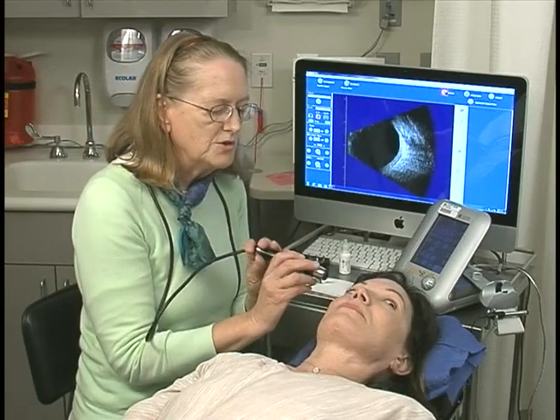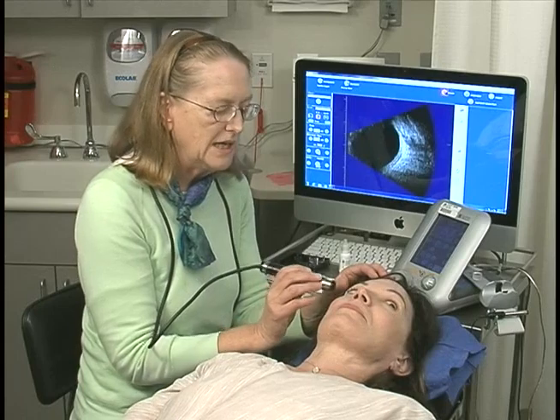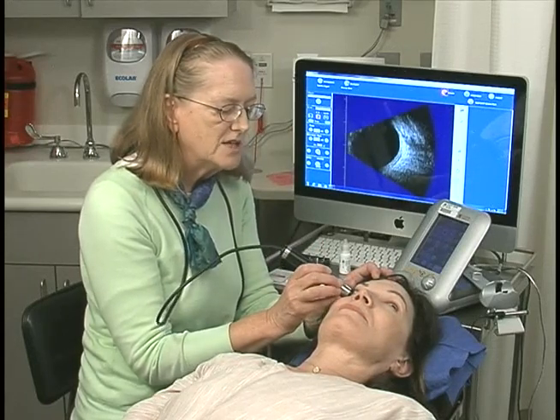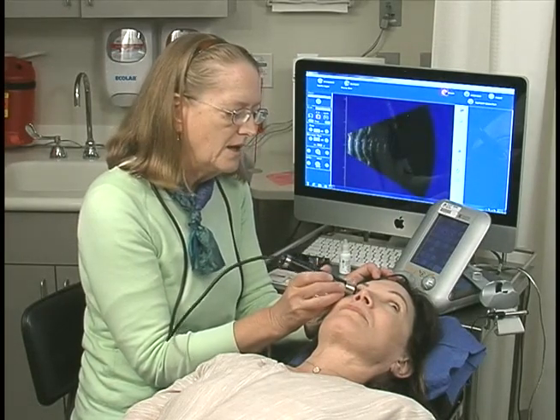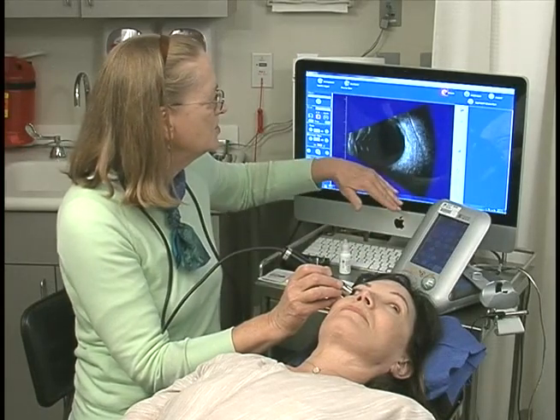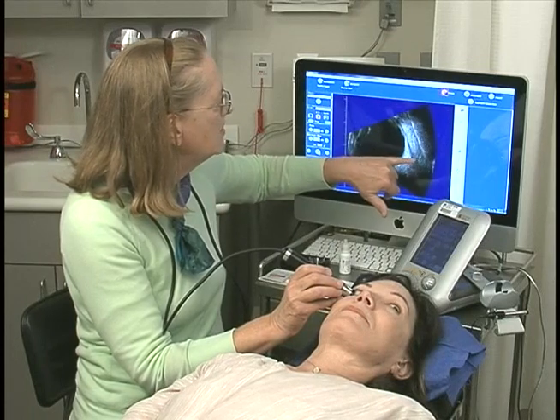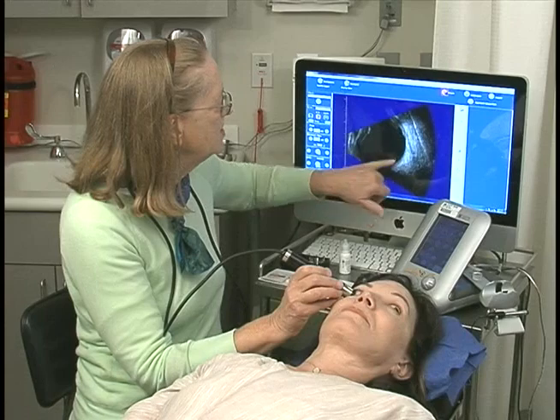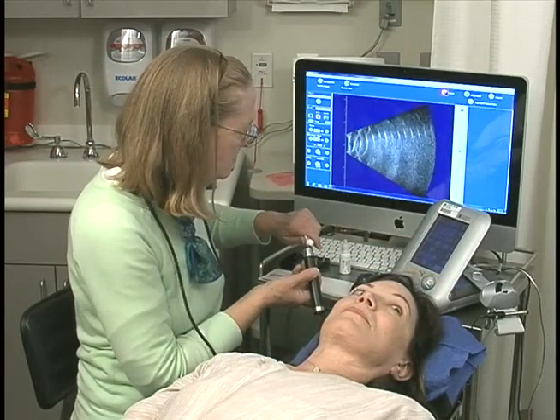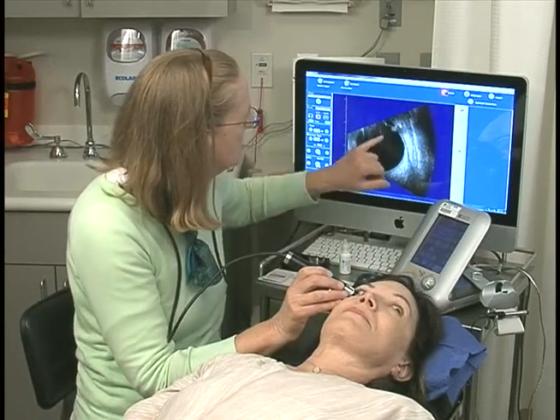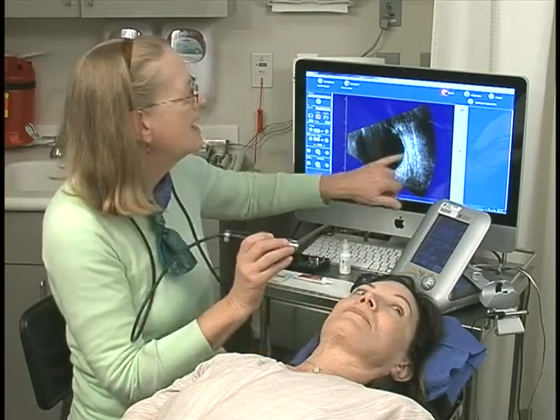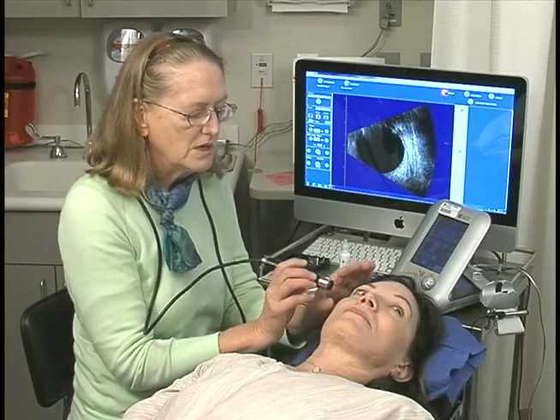Now look to the left. This is a very useful position where there is no eyebrow or nose to limit my mechanical position of the probe, and it allows me particularly in dense cataract patients to see the entire back of the crystalline lens to differentiate the types of cataracts. My probe is in the fornix, the marker is pointing to 3. Optic nerve at the bottom where the echoes just stop from the optic nerve shadow. We have the medial rectus muscle, the belly and the inserting tendon — so optic nerve, equator, anterior periphery of 3. She does not have a cataract so we're not even seeing the back of the lens. But here we can see the ciliary body, the pupil and the edge of the iris. We're not seeing her posterior lens capsule because it's so clear.